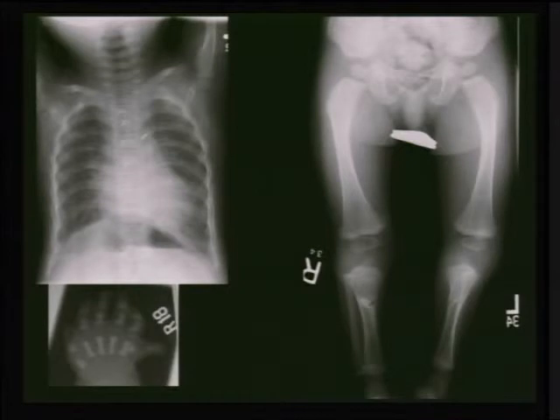This is also a very specific disease, and you can shine up by having the diagnosis. Just look to the chest. It is a little bit narrow chest. If you look to the hands, they can have post-axial polydactyly. And the most specific picture in this one, look to the tibia. There is a V-like lucency in the tibia. You don't see it in any other bone dysplasia.